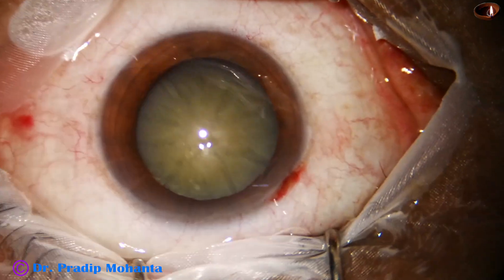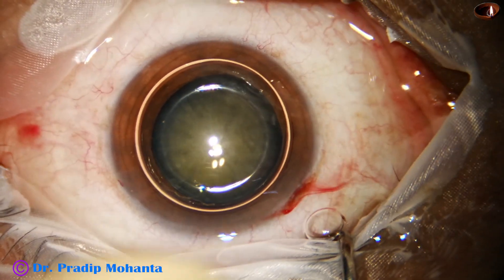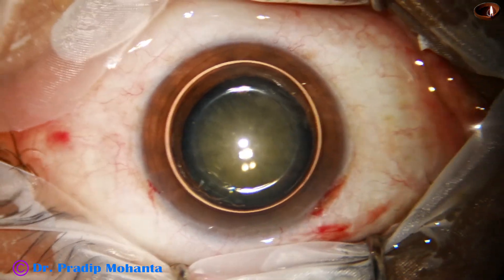If we make a side port 90 degrees away from the main incision, the astigmatism induced by the main incision is neutralized to some extent by the side port.